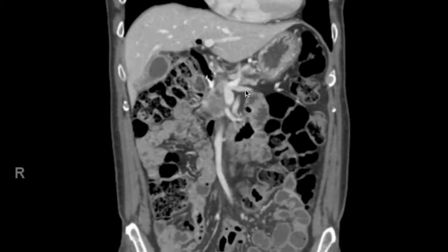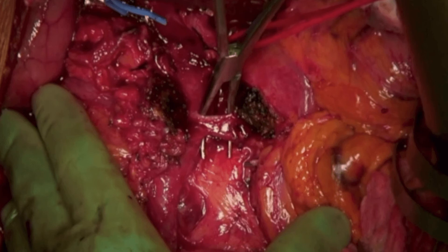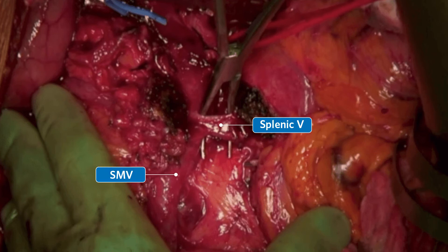In this patient, the inferior mesenteric vein drains into the splenic vein just to the left of the splenic vein–superior mesenteric vein confluence. The splenic vein enters the confluence cephalad, suggesting it should be easily retracted further cephalad to gain access to the proximal superior mesenteric artery. We will now show the relevant operative technique. The pancreatic parenchyma has been transected and we see the splenic vein, the superior mesenteric vein, and the superior mesenteric artery, which is still covered by soft tissue. The tumor is seen here adherent to the superior mesenteric vein–portal vein confluence.